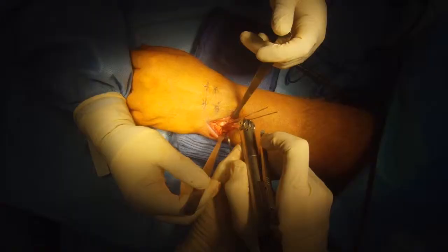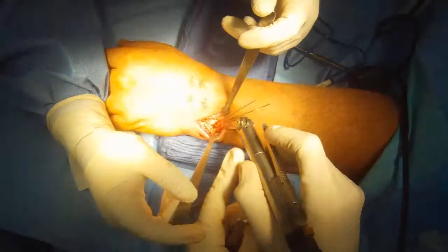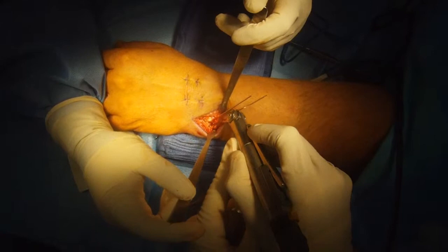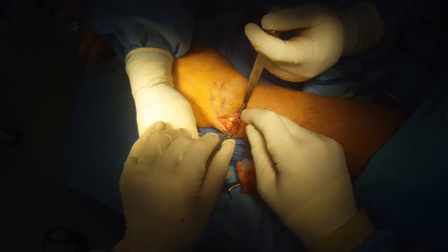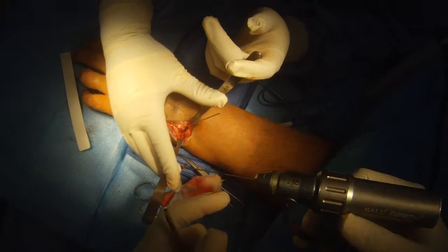Use the saw blade to go all the way through but not past the far cortex of the bone. I'm going to remove a little triangular shaped piece of bone.